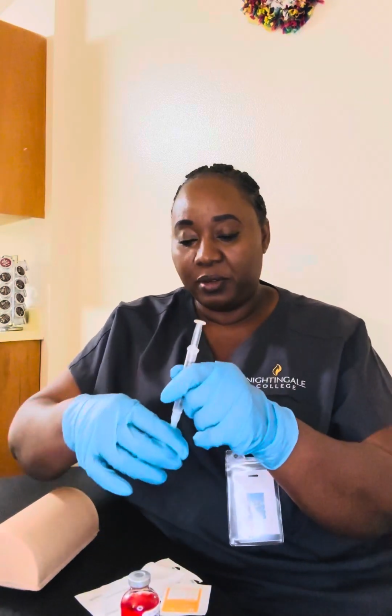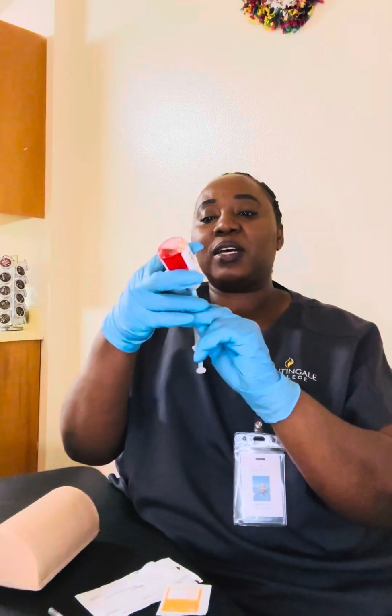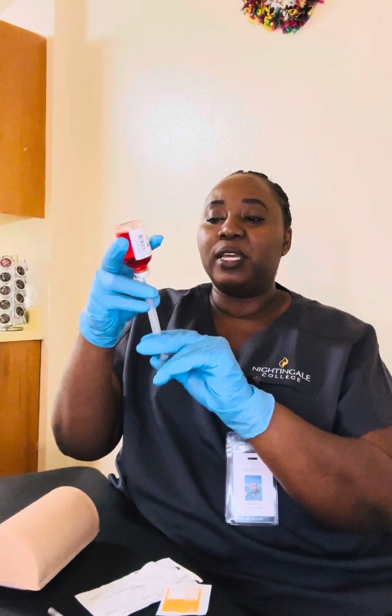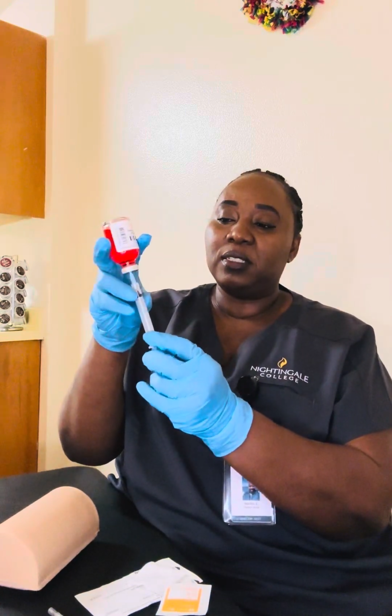I'll make sure I pull the plunger to 1 ml to make sure I can push 1 ml in before drawing the heparin. Straight down as if I'm holding a pencil. Gently invert the vial, push the air in, and then draw.